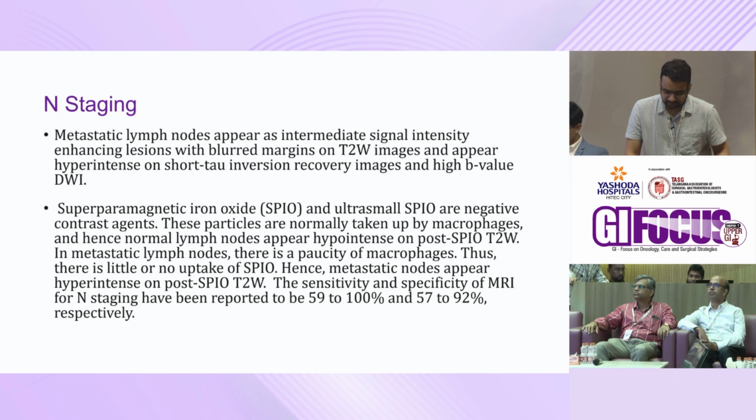And metastatic lymph node involvement can also be made out by T2 images and diffusion weighted images, where we can see restricted diffusion in the metastatic lymph nodes. Thank you.